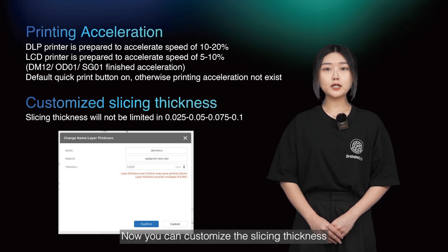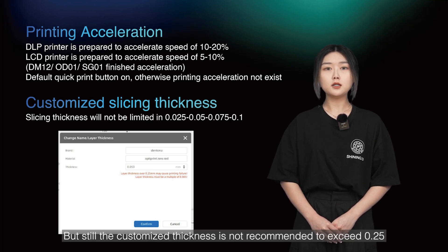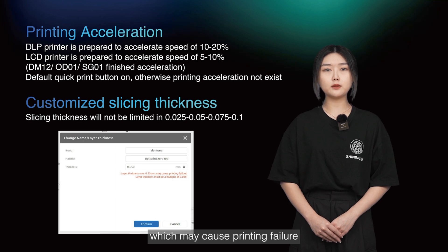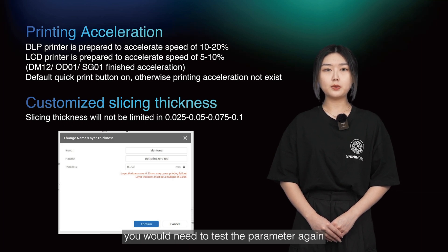Now you can customize the slicing thickness. Thickness will not be limited to 25, 50, 75, and 100 microns. However, the customized thickness is not recommended to exceed 250 microns, which may cause printing failure. A friendly reminder: when you change the layer thickness, you will need to test the parameters again, otherwise this may cause printing failure.